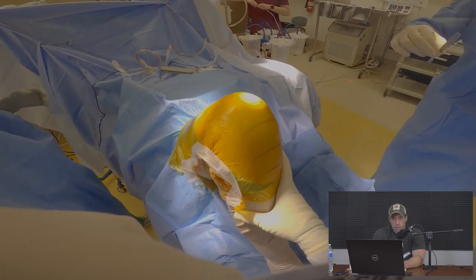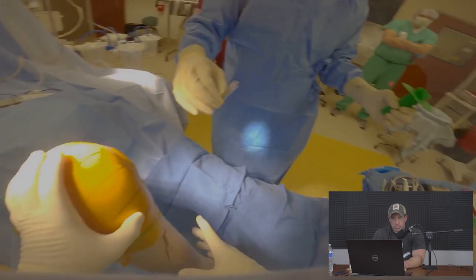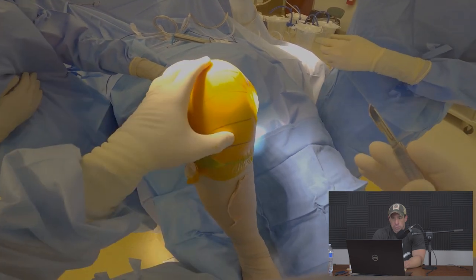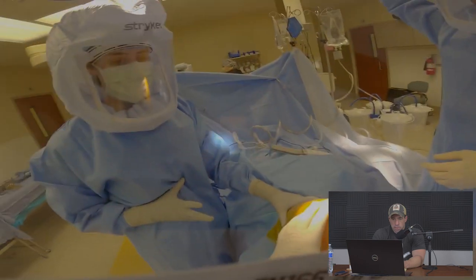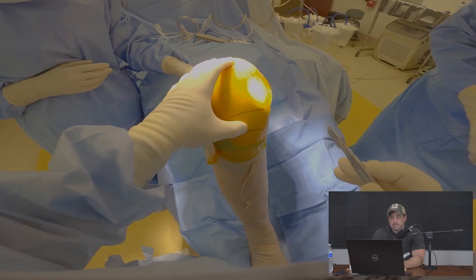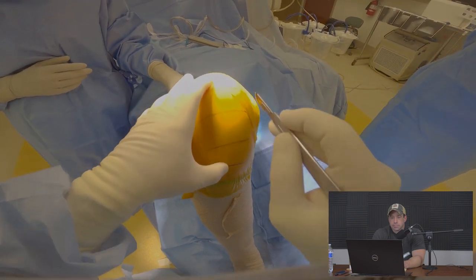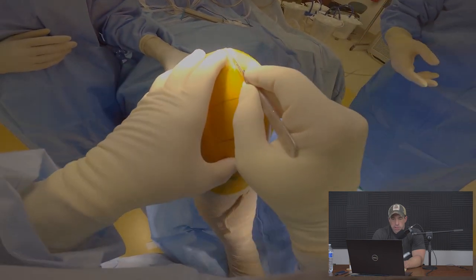With the knee fully prepped and draped we are ready to begin. I'm feeling for anatomic landmarks — in this case the tibial tubercle and the patella — and we're beginning the skin incision.